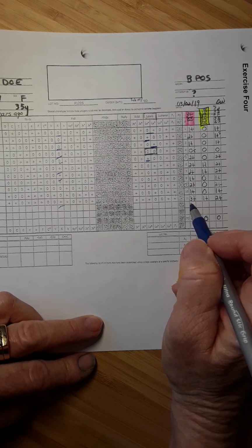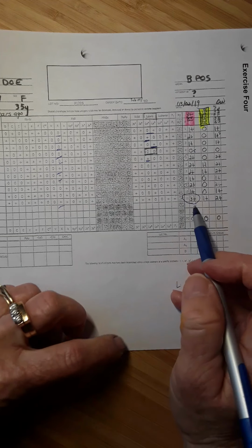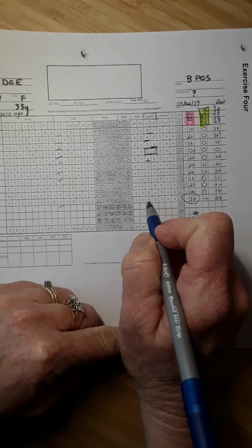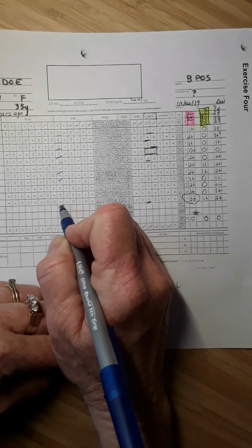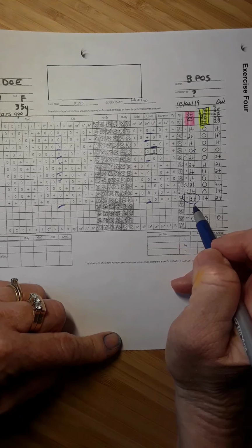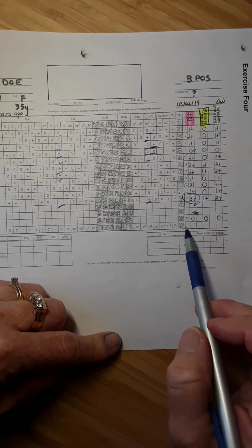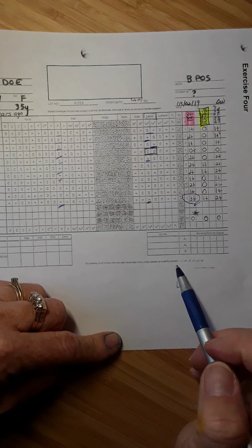Probably one of the more interesting reactions that I'm seeing is this one here, this 3+ reaction. So sure enough, that cell is positive for Lewis A, which was reacting about 2+, and positive for Kell, which was reacting about 1+. So that makes sense. So I do always look back through these reactions and make sure that they make some sort of sense to me after I've made my decisions about what's present in the patient's plasma.